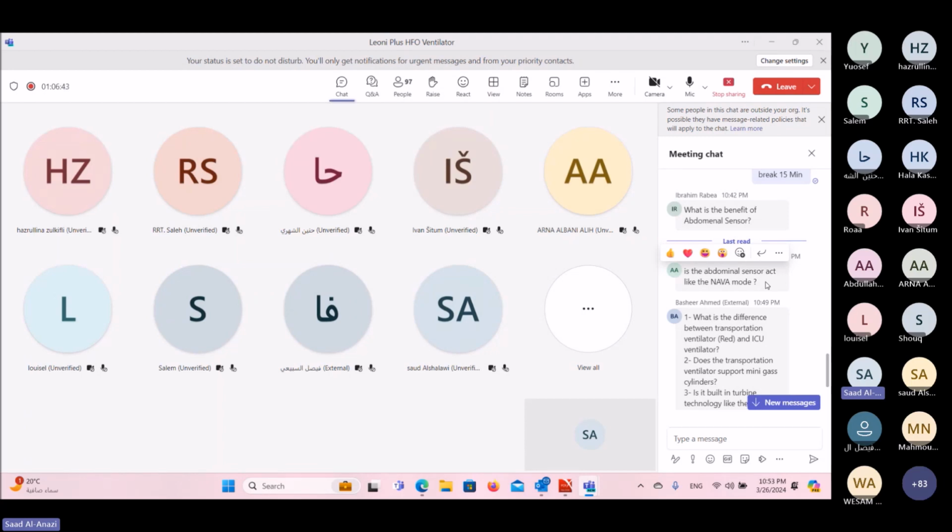A specific NGT is inserted, with a specific sensor behind the heart, close to the diaphragm, to sense the diaphragm contractions, to be better spontaneously breathing.